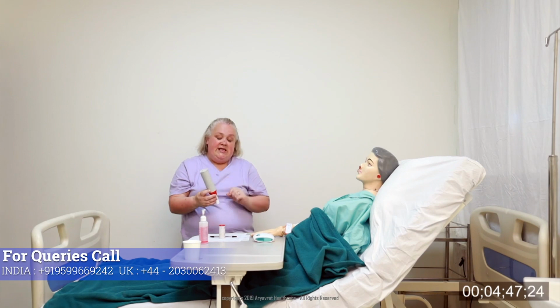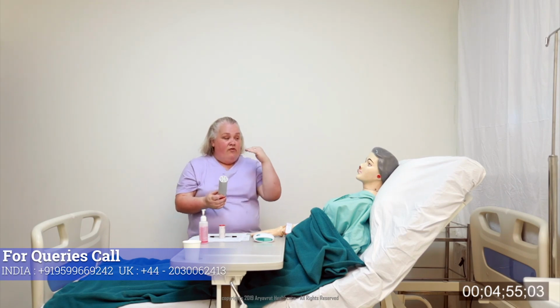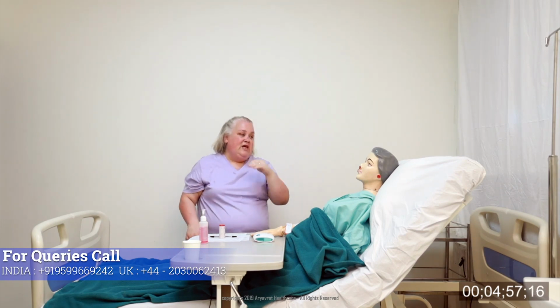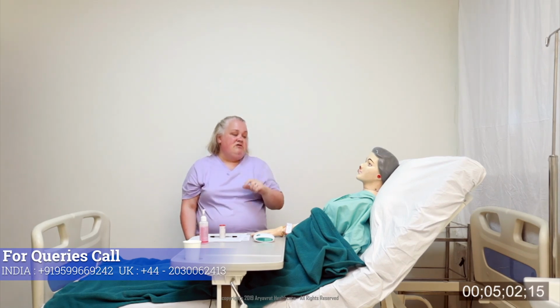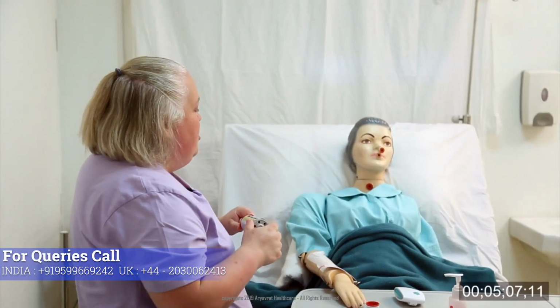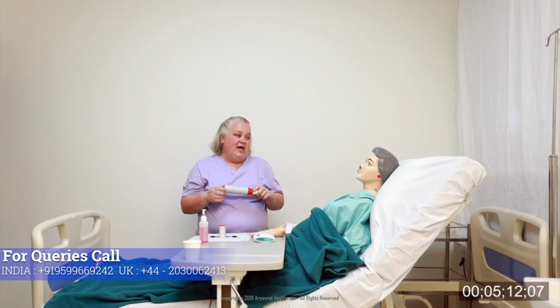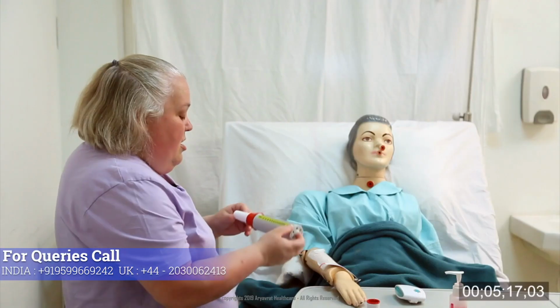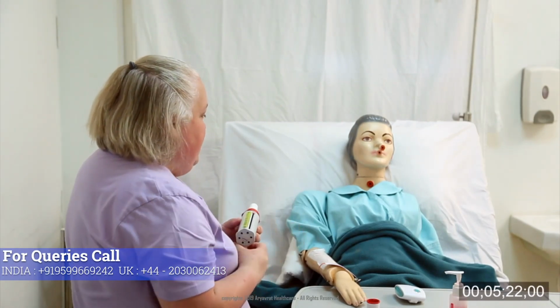They're worth 10 each. If there is a greater difference of 40 between your 3 readings, so say you got 300, 350 and 360, there's a 50 difference between the first and the second reading, so that's greater than 40. We'd need you to do 2 more to make sure that we've got an accurate reading. Okay, so it would be the best of 5 in that case instead of the best of 3. Okay? So, I would like you to demonstrate how you can do that for me and do 3 readings.